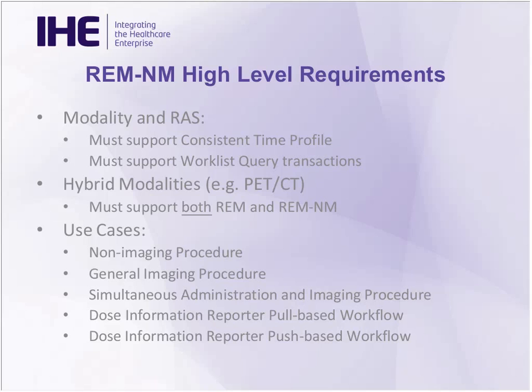Also, with hybrid scanners, both the CT side and the PET, or the CT side and the SPECT, can now report and will either consume the REM-NM report and then produce a CT REM for the CT side, so downstream can get a more complete picture of the dose for the patient for those types of scanners.